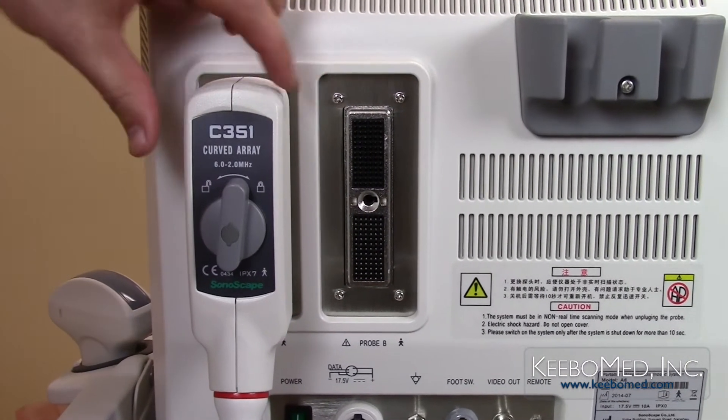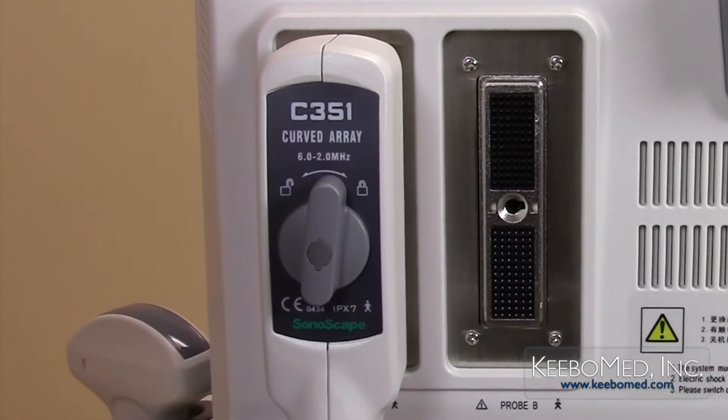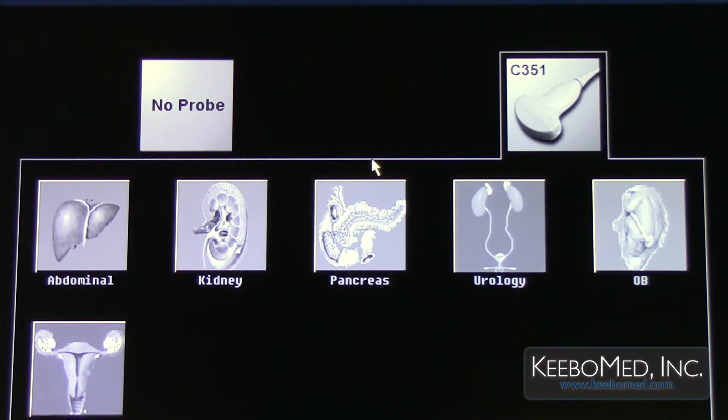Step 4. Check the probe to make sure that it is securely connected. The system will automatically detect the probe and display it on the screen.